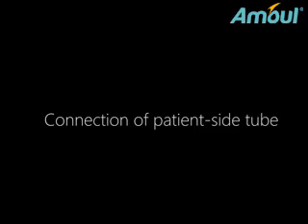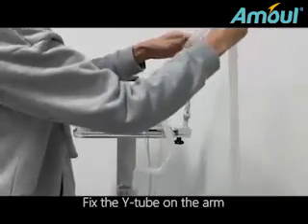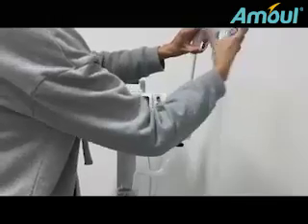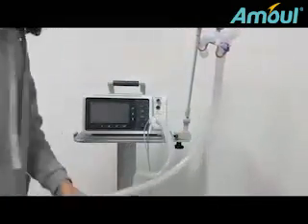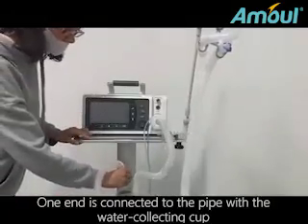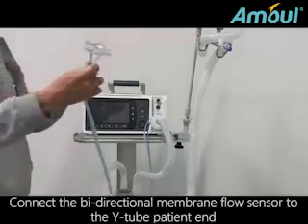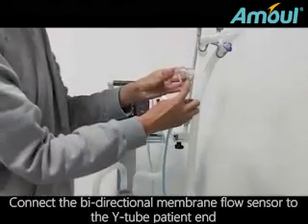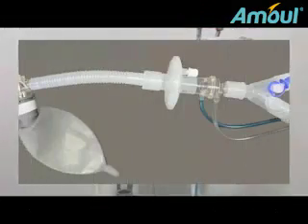Connection of patient side tube. Fix the Y tube on the arm. One end is connected to the pipe with the water collecting cup and connected to the outlet of the humidifier. Connect the bidirectional membrane flow sensor to the patient end of the Y tube. Note that the blue tube faces the patient end.